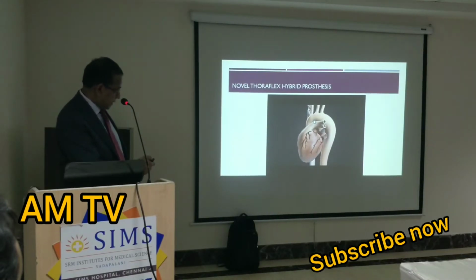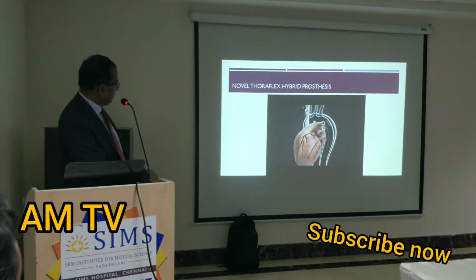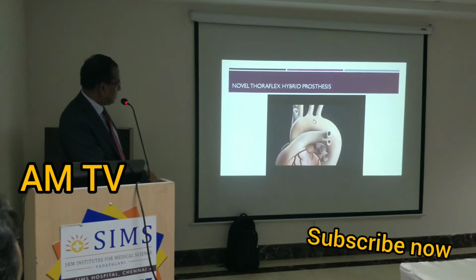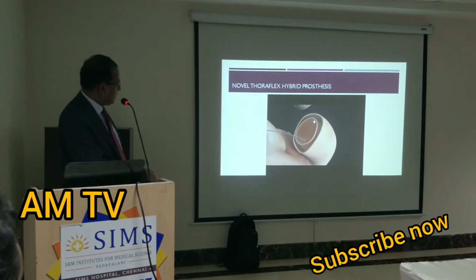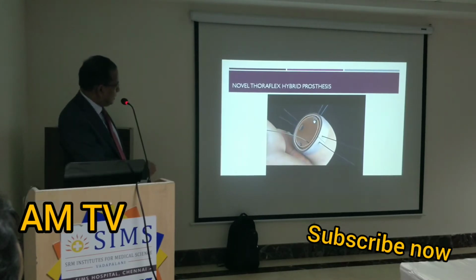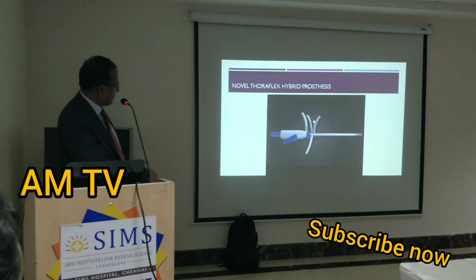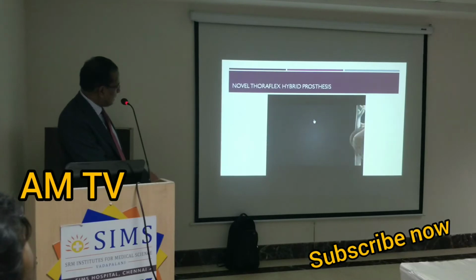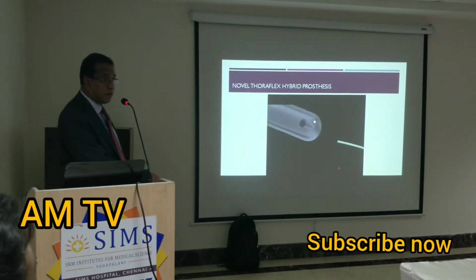Now, this particular graft which we got, we are showing how we do this procedure. It's called a Thoraflex hybrid graft. This is an animation of the graft, where we stop the heart and cool the blood to about 25 degrees. This is the graft being deployed into this part of the aorta. You can see this graft, the lower part which goes inside and fixes all the tears inside the lower part of the aorta.